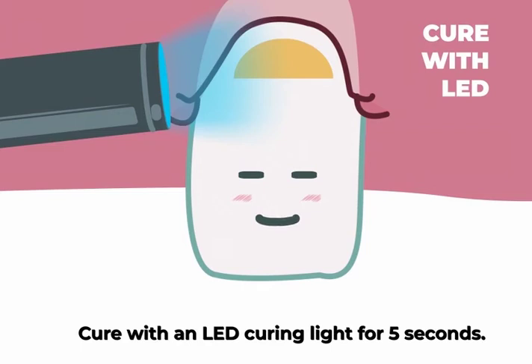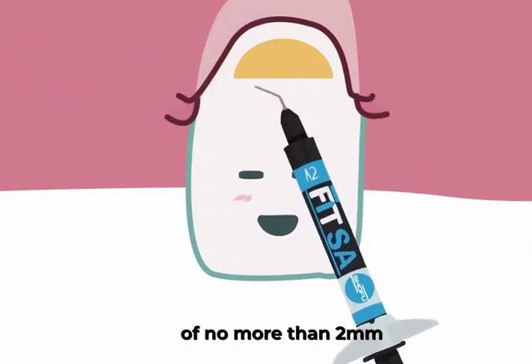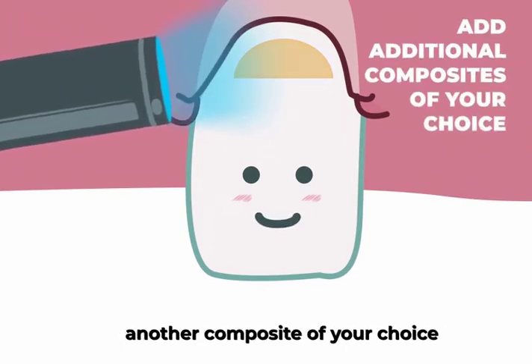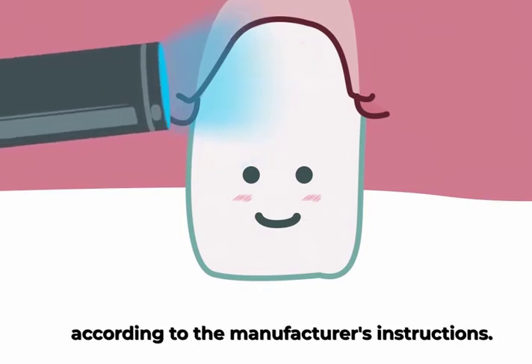Cure with an LED curing light for 5 seconds. Add additional FitSA in increments of no more than 2 millimeters and light cure each increment for 10 seconds. Or add and cure additional increments of another composite of your choice according to the manufacturer's instructions.